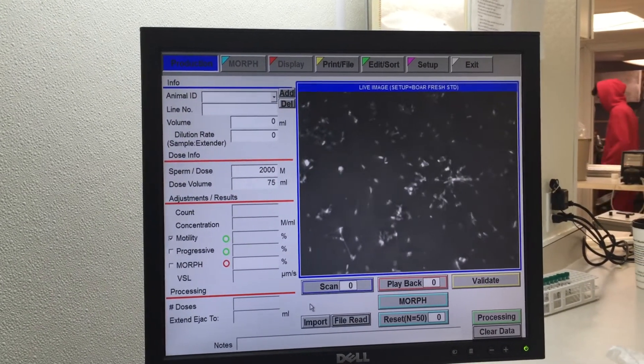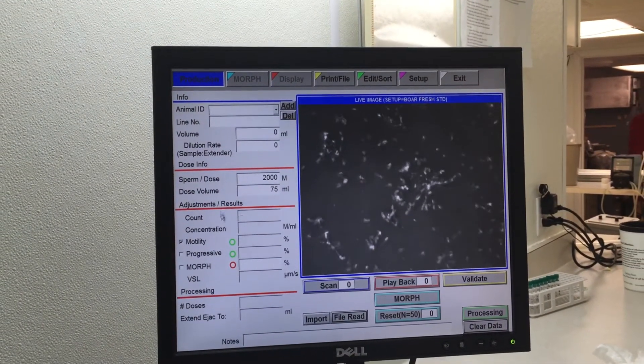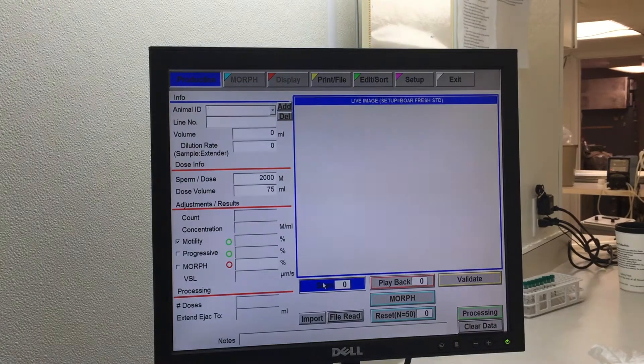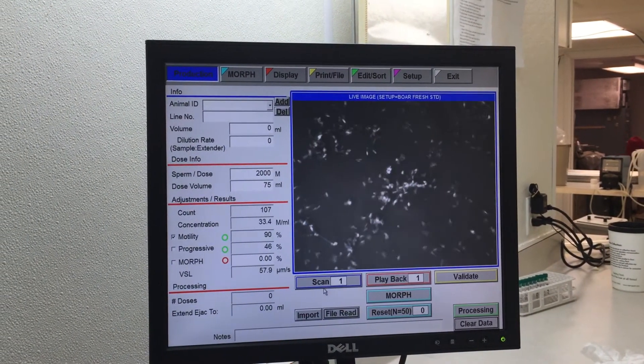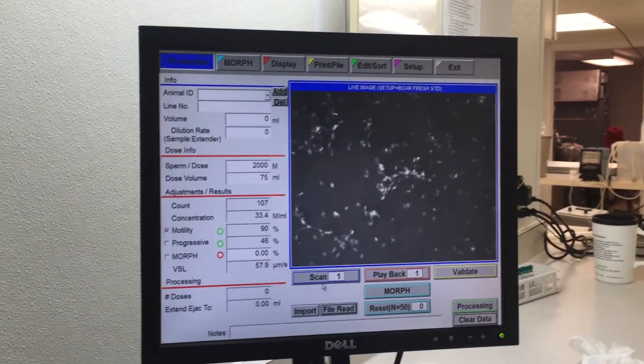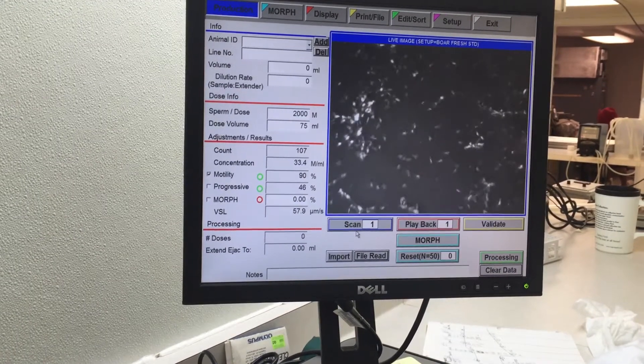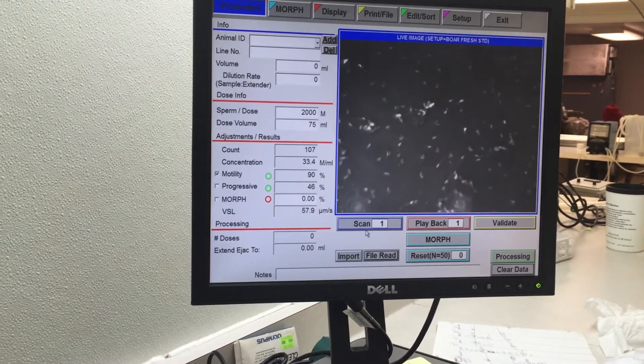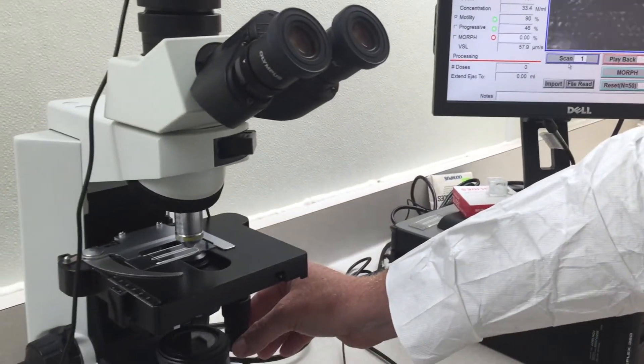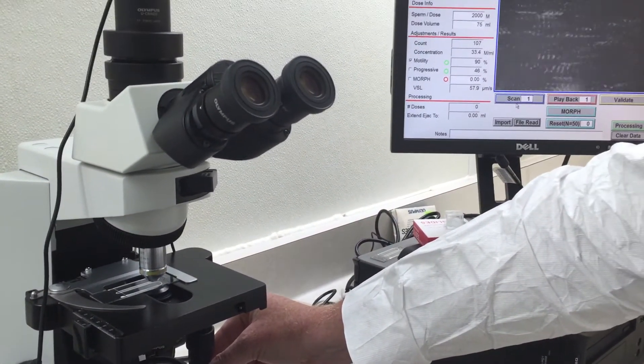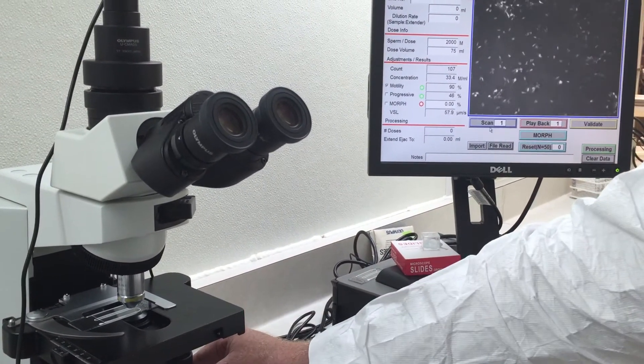But for an eight-day-old sample, we still probably have eighty percent motility here. I can actually cheat and have the CASA scan it. The CASA is saying that it's ninety percent motile, so we have good motility. You can move the slide around to get different views, and you can see this sample is motile and still good enough to use even though it's eight days old.